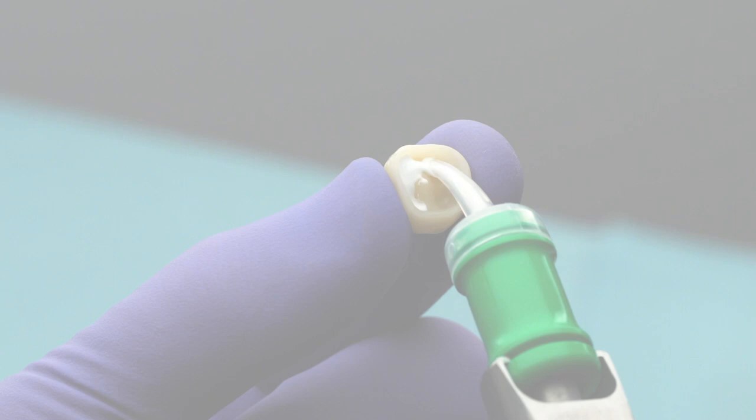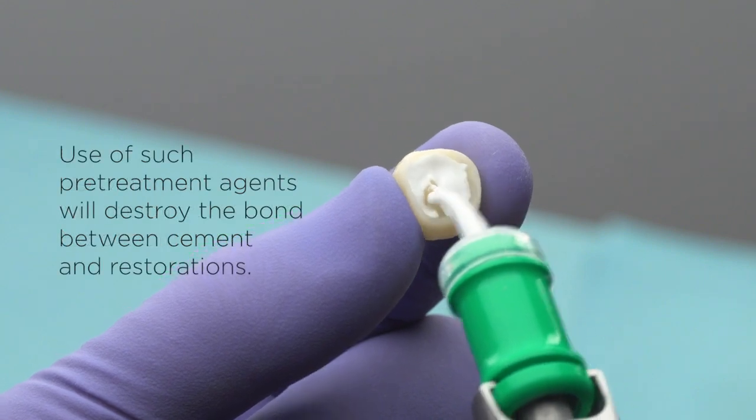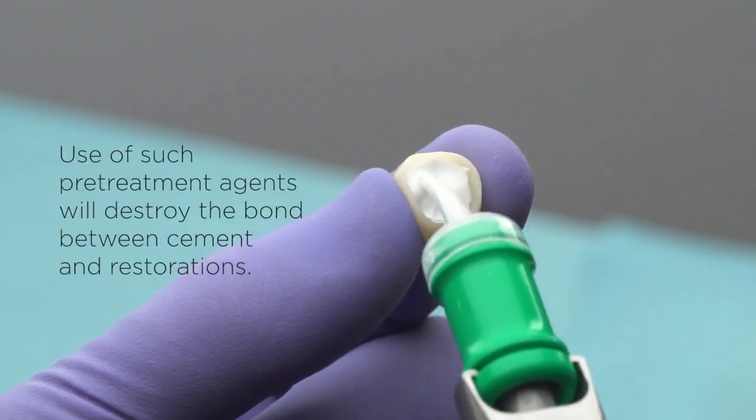Apply a thin, uniform layer of cement by gently squeezing the lever 2 times. No priming, bonding, or conditioning agents are necessary. Use of any such pre-treatments will destroy the bond between cement and restoration.